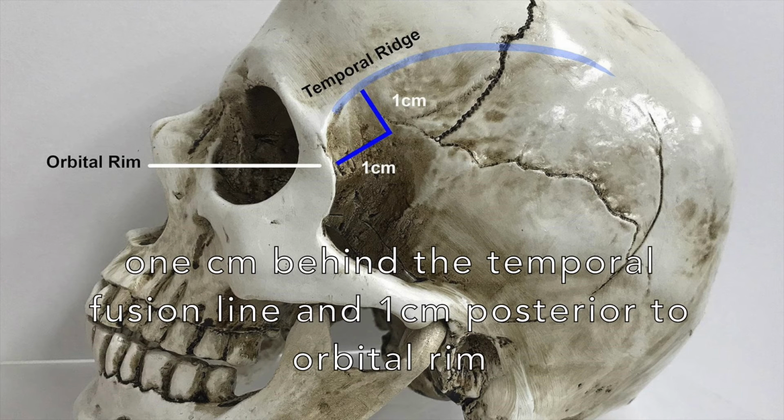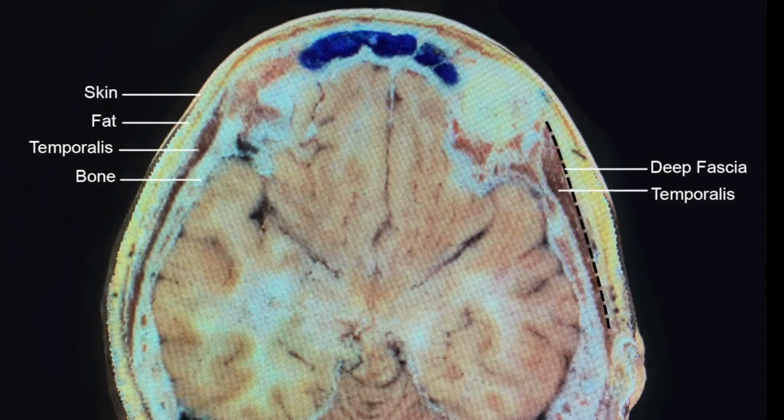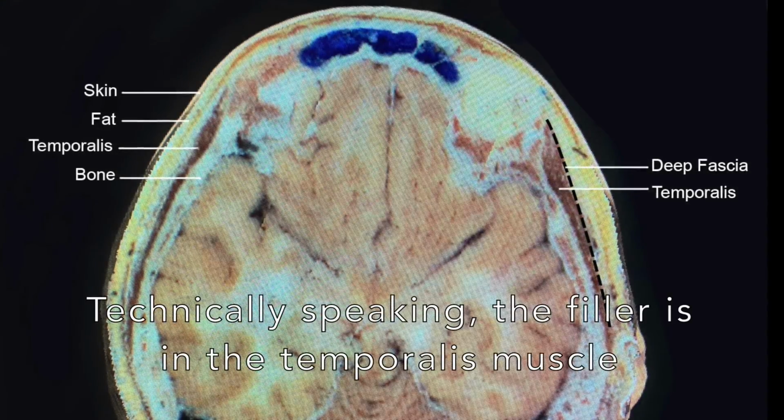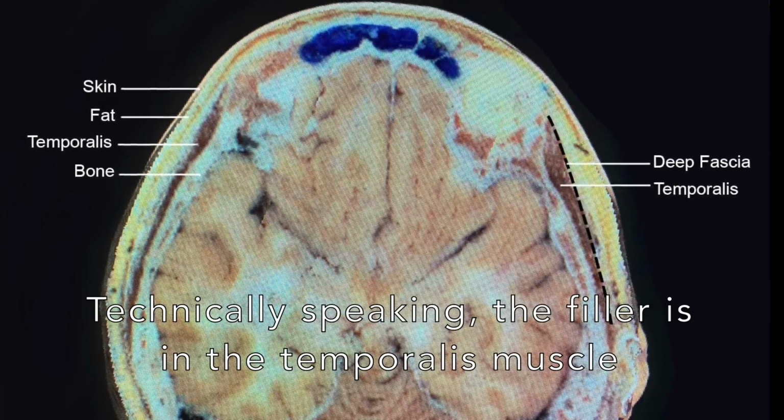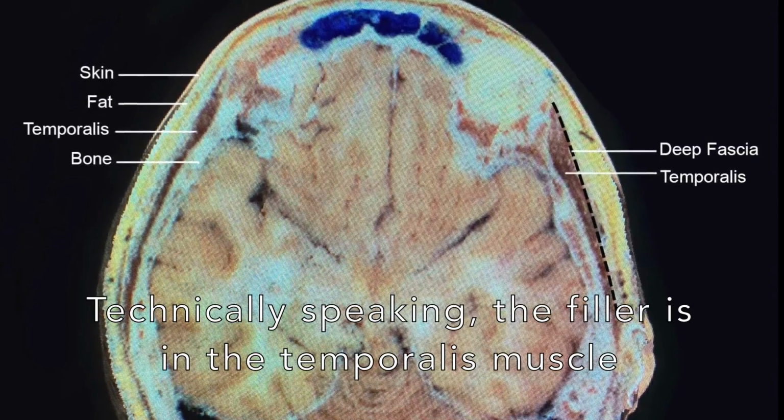The entry point is identified as 1 cm behind the temporal fusion line and 1 cm posterior to the bony orbital rim. Technically speaking, the filler is in the temporalis muscle, which is firmly attached to the bone.